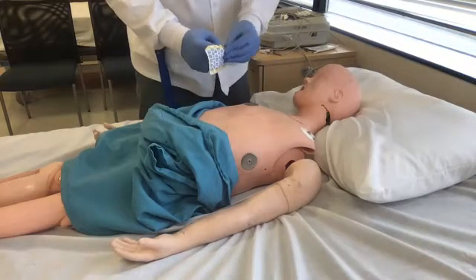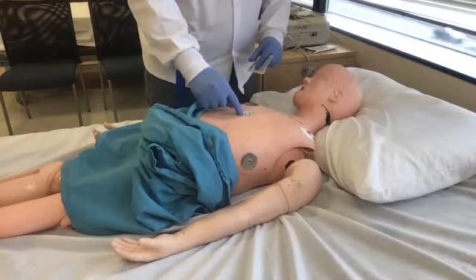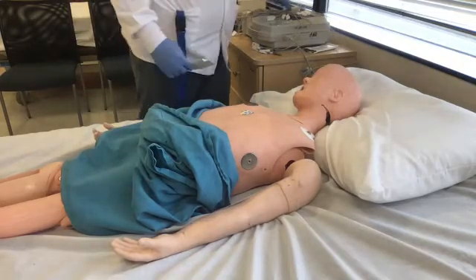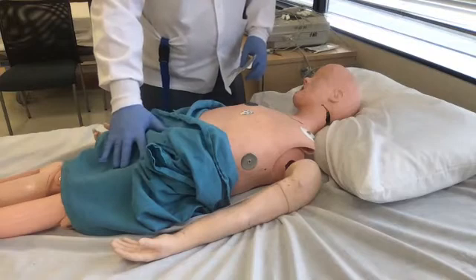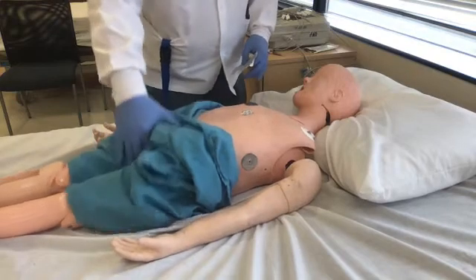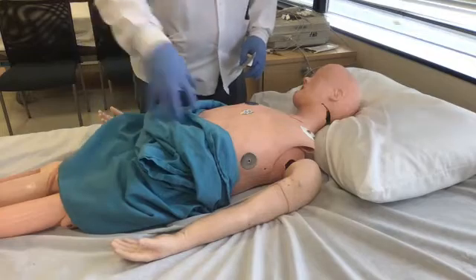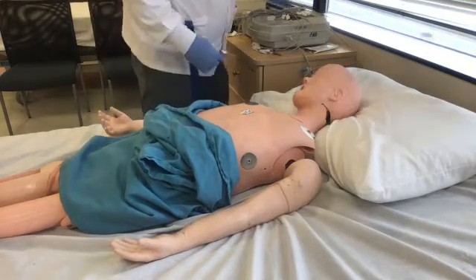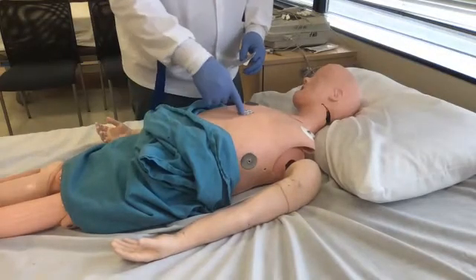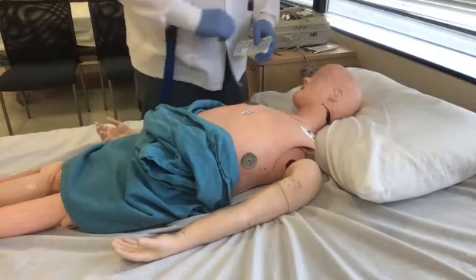Now, everything that I'm going to put on the chest, the tabs have to face down because I'm going to put the hub, or this thing here. Now, the textbook says to put it around here, but that's near his junk. So what's going to happen? If I put it here and I accidentally touch that, we have a nice little lawsuit on our hands. So I like to put the hub, or the place where all the wires meet, right here near their hip. But you want the tabs facing down so that the wire doesn't back in on itself and then come out.